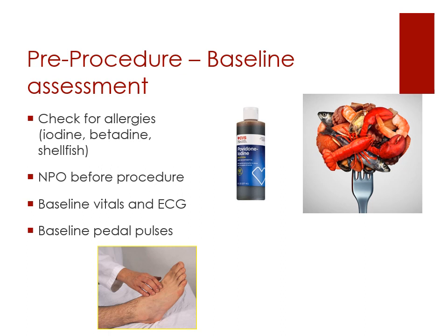So as soon as the procedure is done, we just go right to that area, and you should see no change in those pedal pulses. If there's any change in the pedal pulses, or if they are less than what they were before, please let the doctor know right away, because we need to make sure that we haven't now caused 2 problems: occlusion in the upper part and now occlusion in the lower part of the leg.